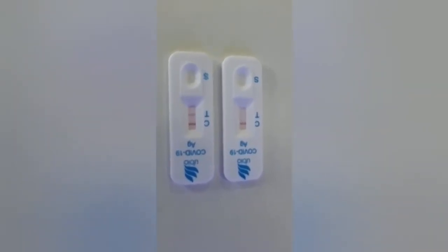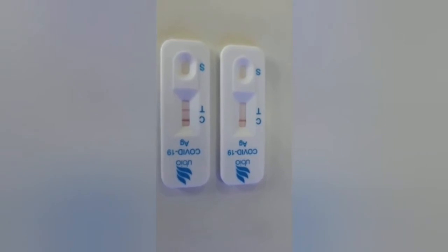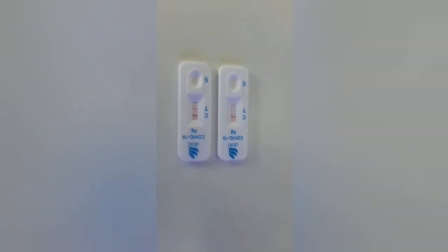If the control line C is not observed, it will be invalid regardless of whether there is a test line, and the test shall be conducted again.